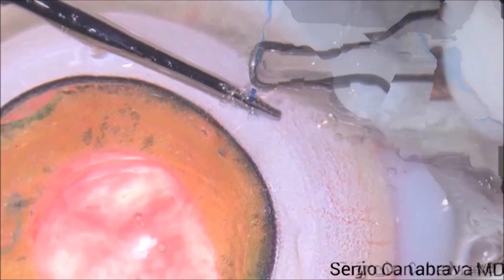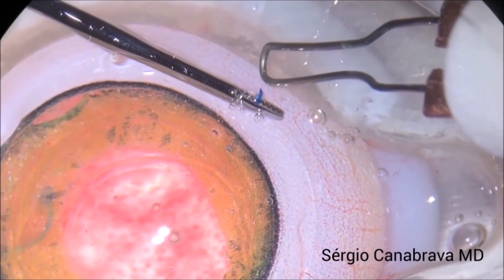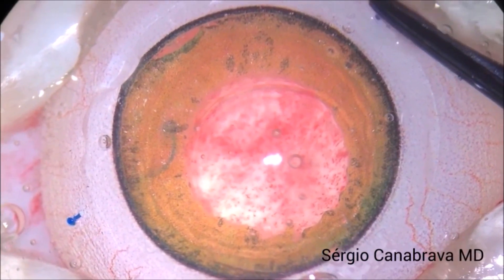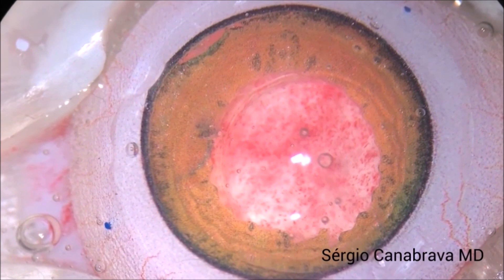After that, we cut the suture 2mm from the bottom on both sides and make the third and fourth flanges, inserting the flanges inside the sclera. Now observe how stable the IOL is.